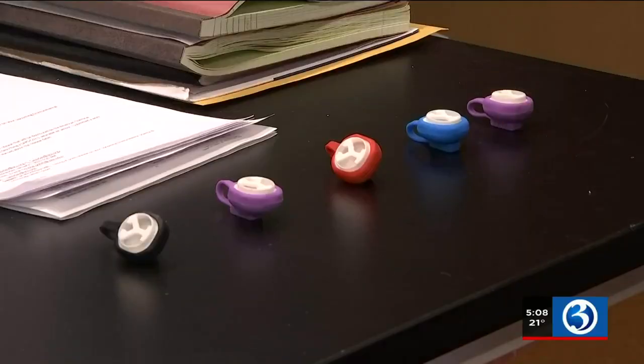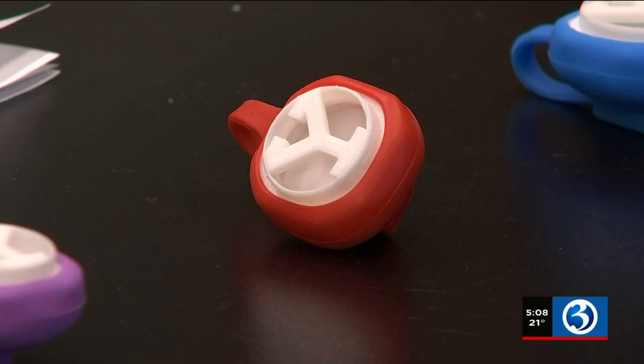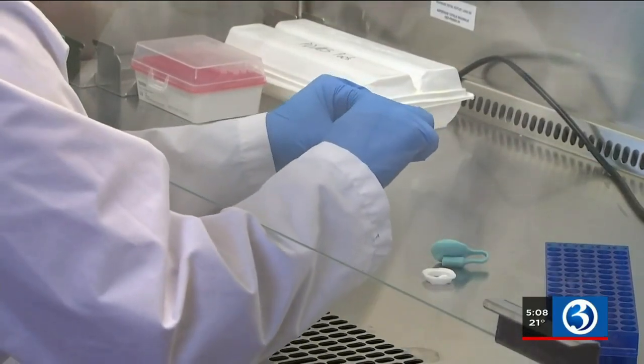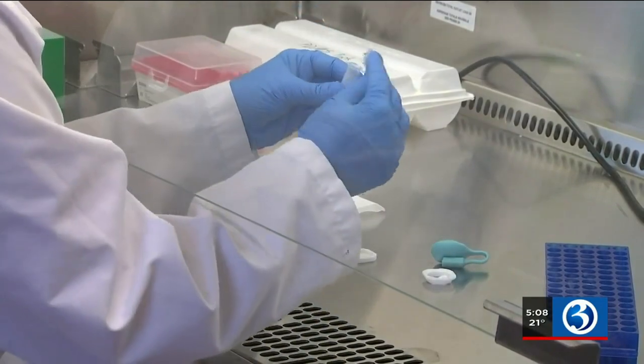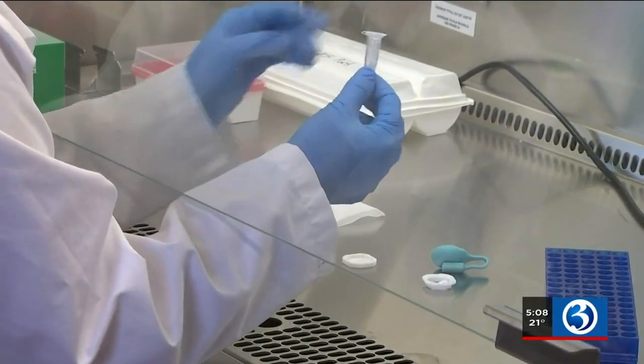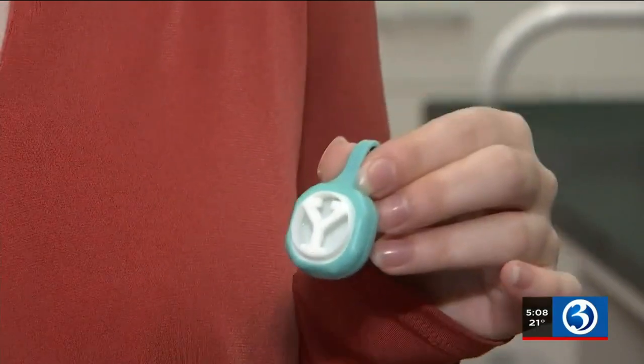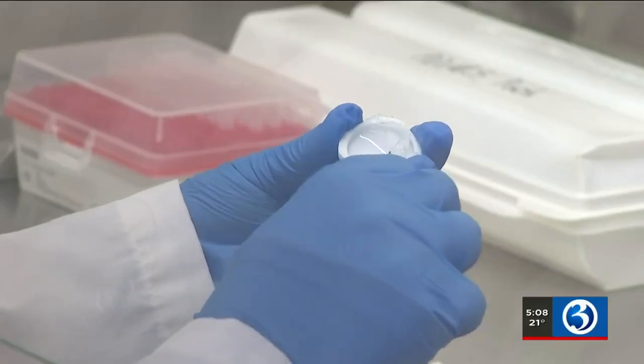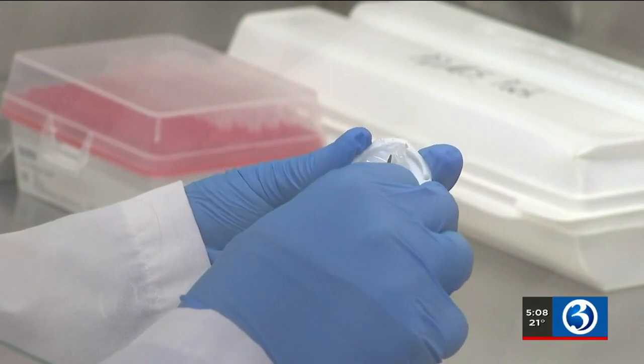The device is not going to give readings or results in real time. The clip simply collects air samples. Researchers from Yale School of Public Health initially created it to detect air pollutants. Darryl explains, this film will allow airborne particles to passively deposit onto the surface of this clip. When COVID hit, researchers pivoted because this film can also capture virus particles.